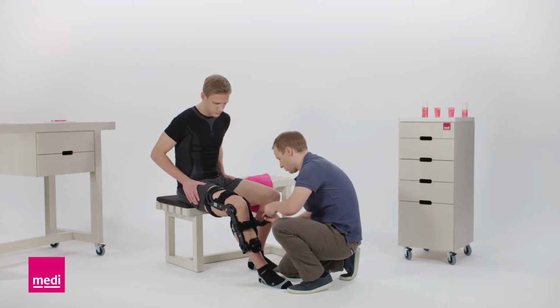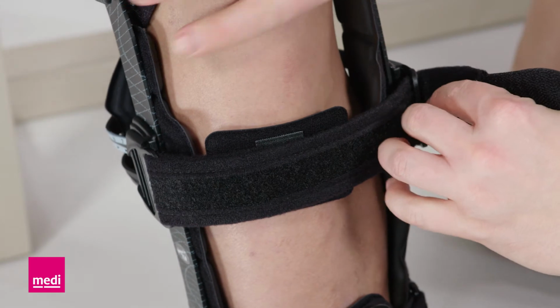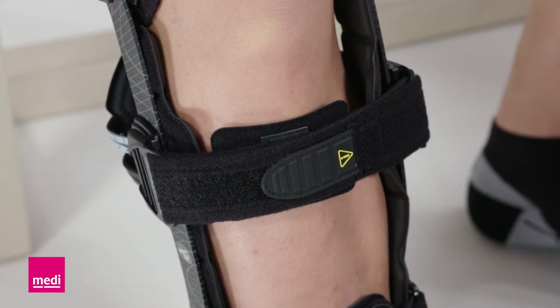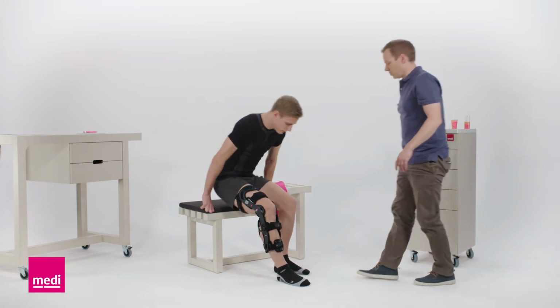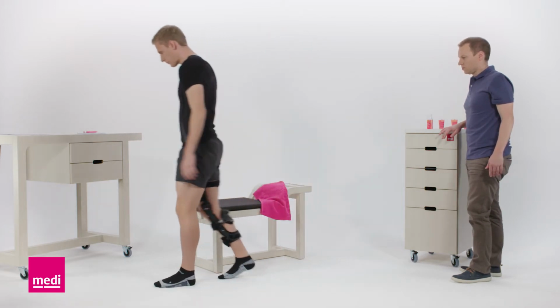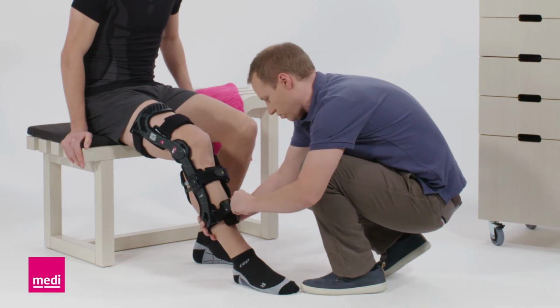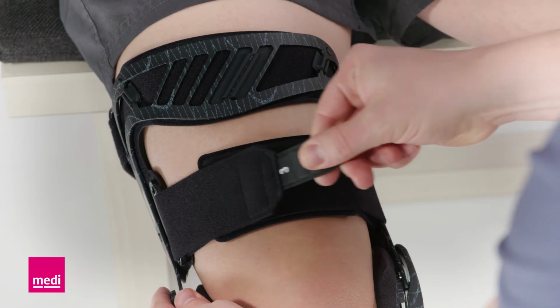You can achieve additional stabilization by fastening the tibia belt. This must always be the last belt to be fastened. The belt, however, is not a necessity. To be certain that the orthosis is positioned correctly, you should have the patient take a couple of steps. Once again, check for correct position and, if necessary, regulate the belt so that the orthosis is positioned securely on the leg.